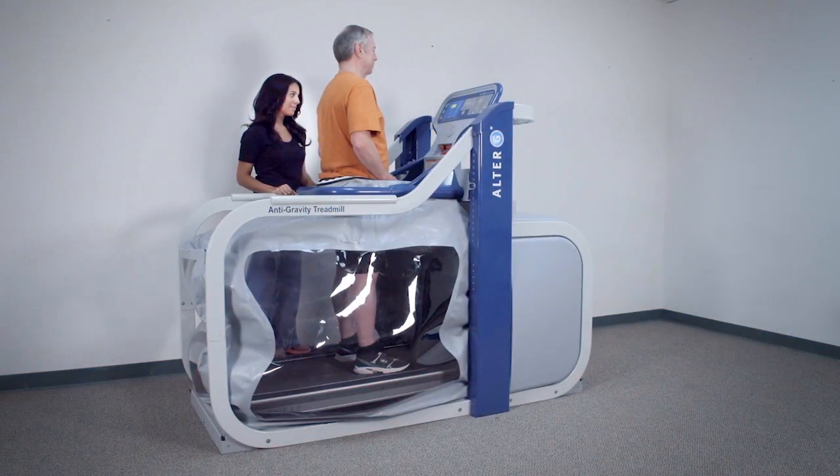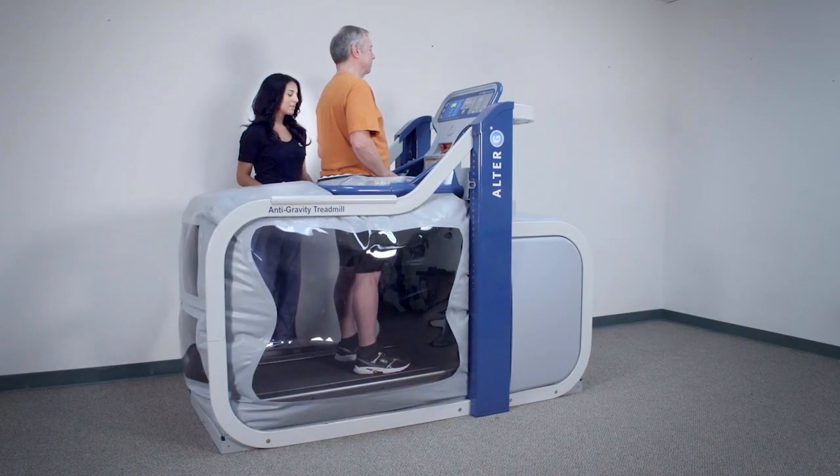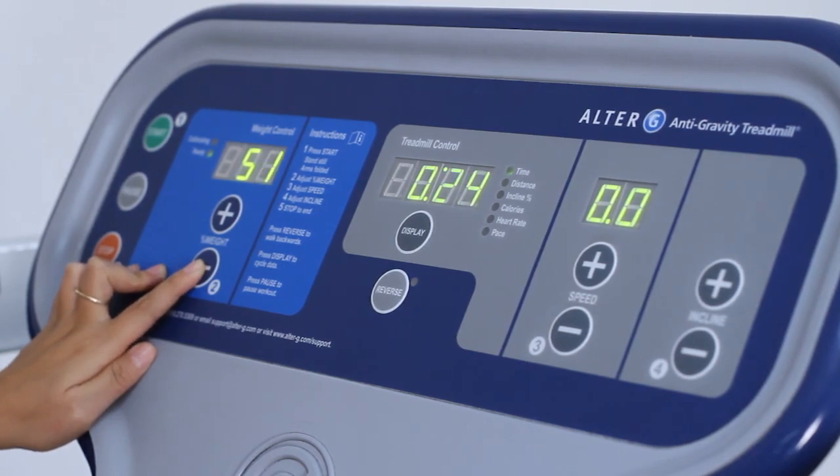Our unique NASA patented differential air pressure technology allows you to unweight patients down to 20% of their body weight in 1% increments. This enables patients to rebuild strength and confidence.